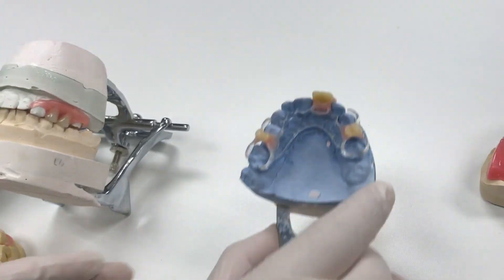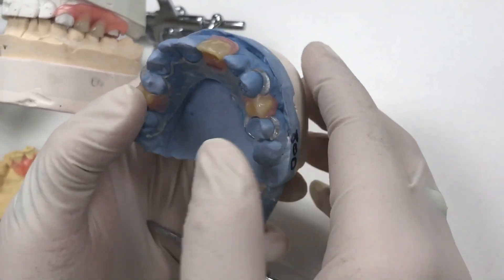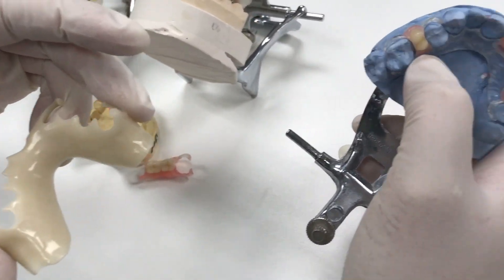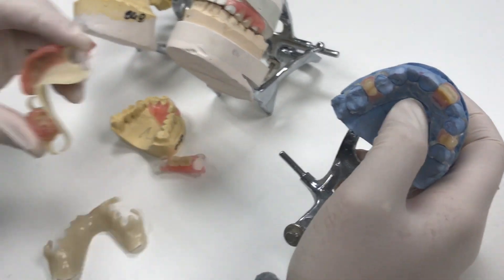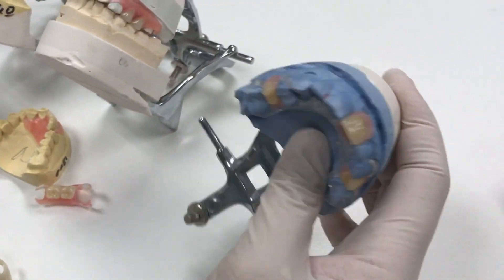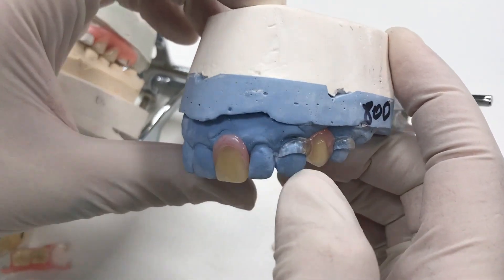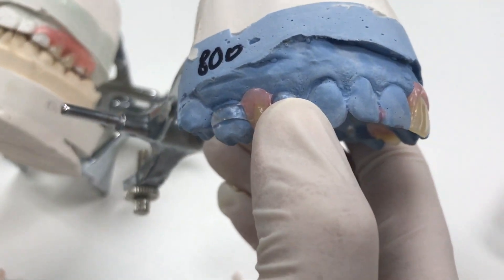This is one of our newer products — a clear frame partial. It's a single shoot just like the Duracetal: the clasp and the frame are all one piece. Then we process it just like this one — cut a few retention holes in it and process on the acrylic. So you get a good dual partial as well, and the clasp blends into the tooth without having to match two different products.